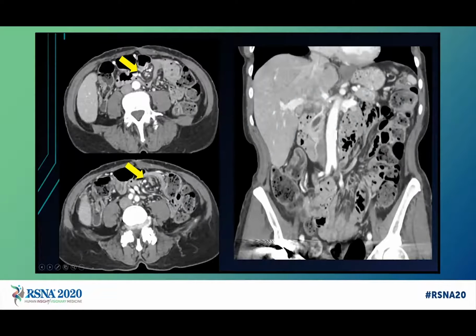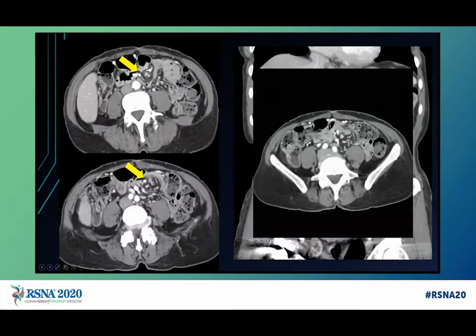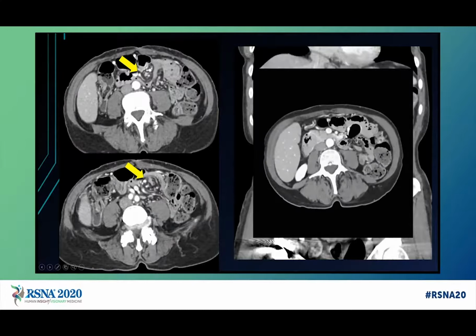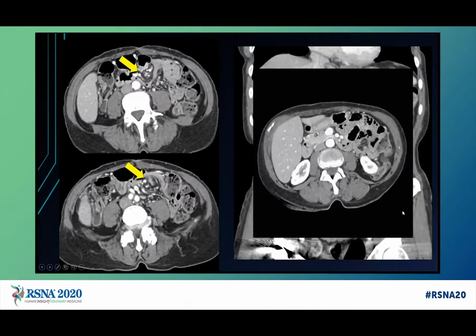Now, what about this patient here? This is a patient who is asymptomatic, who came into the outpatient imaging center to evaluate for a possible abdominal wall hernia, which wasn't there. But they have this twisted appearance, this rotation appearance to their small bowel mesentery. There's no small bowel dilation. There's no mesenteric edema. I'll scroll through the images here so you can see this twisting of the small bowel in the central abdomen here, close to 360 degrees of rotation.